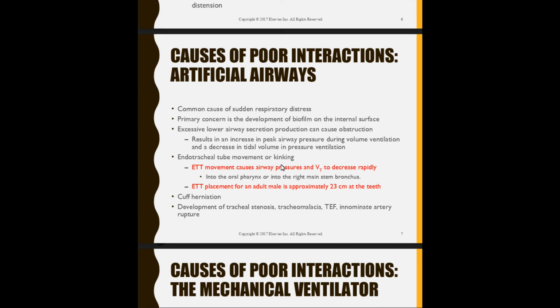Besides the fact that they're breathing through the tube, you also have the balloon. The balloon blocks everything else around the endotracheal tube so that airflow will just move through the tube, right? Now, let me ask you this. Do we fully inflate the cuff or the pilot balloon? No, we don't. Right? We have something called minimal occlusion volume or minimal leak technique.